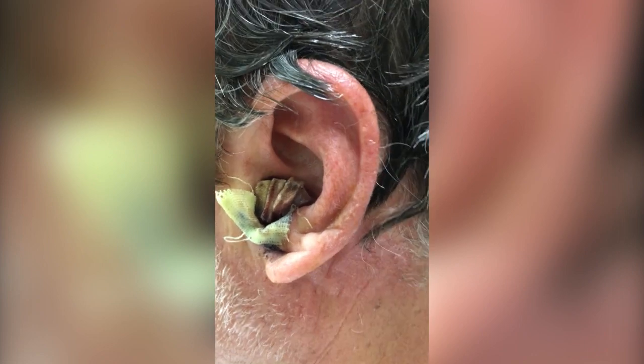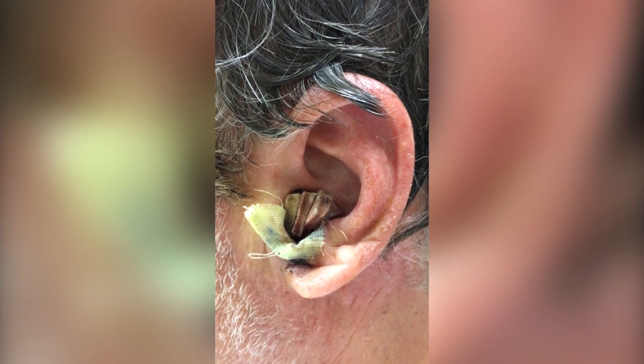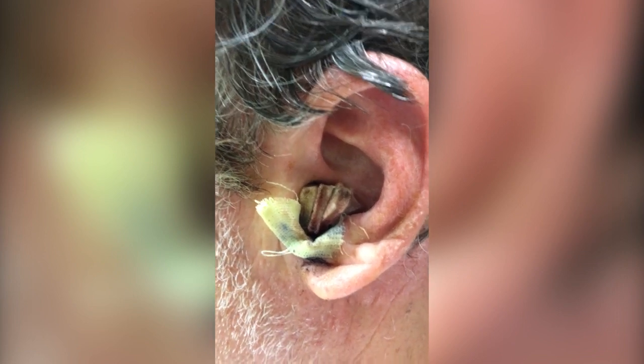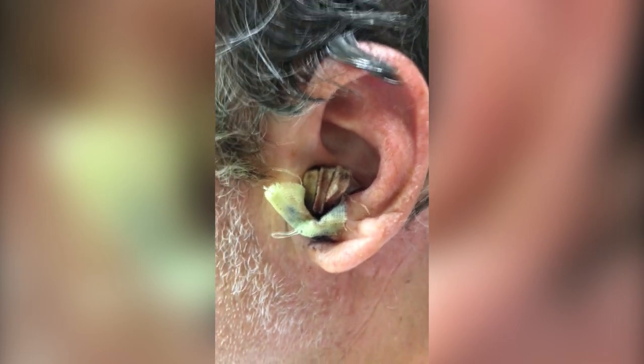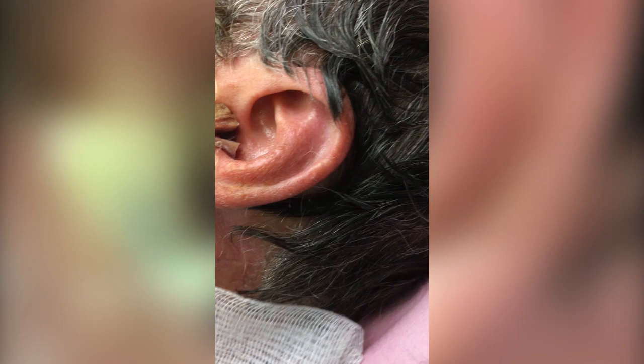We have taken the dressing down — it's been about five days. We want to take this off and I'm keeping my fingers crossed to make sure the graft has taken. Skin grafts are tricky, we know that. So let's find out. I'm going to take off one at a time — you want to make sure the graft has survived really well.